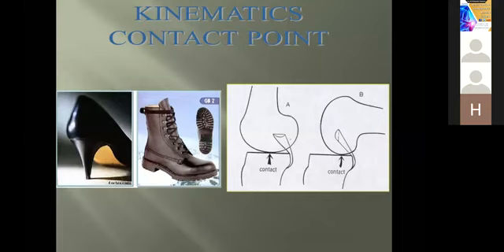If you have these military shoes, they have a wide base, strong, distributing the wear on a large surface area, so that allows the soldier or the worker to accept and to do high load activities. While the very nice feminine shoes in the left picture, although it gives a minimal impression that's hardly noticed, this impression is profound. And if this works on ceramic or on soft tissues, the stress per unit area leaves disastrous and long-standing effects. So the wider the conformity, the less the stress, and the longer the survival.